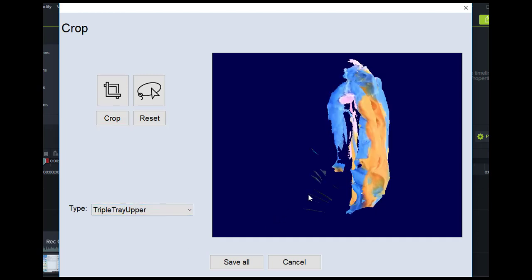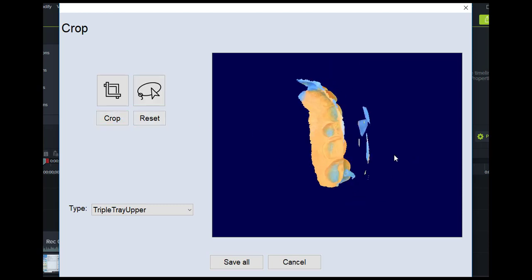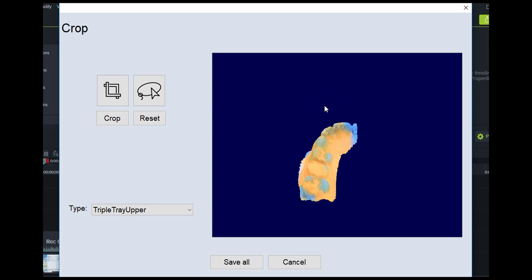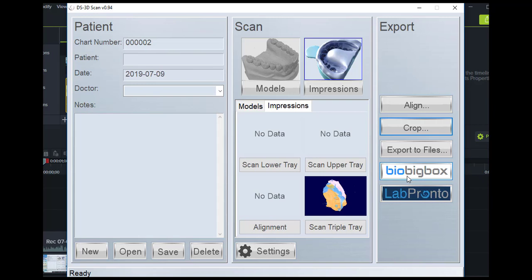So now select the upper, and same type of thing. We look at it, we can now use the lasso tool, and crop, and then look at it from the side view. And crop again. So now we have a nice clean impression. We can save that, and now you're ready to export your data.